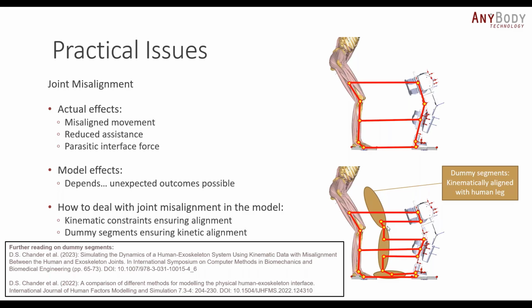So this dummy leg was kinematically perfectly constrained to the human leg. So this was perfectly aligned with the human leg. And then kinetically, what we did was we had the kinetic interface between the human and the exoskeleton, and then the exoskeleton and the dummy segment.